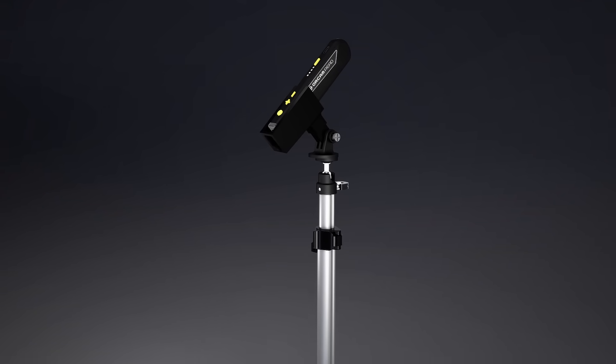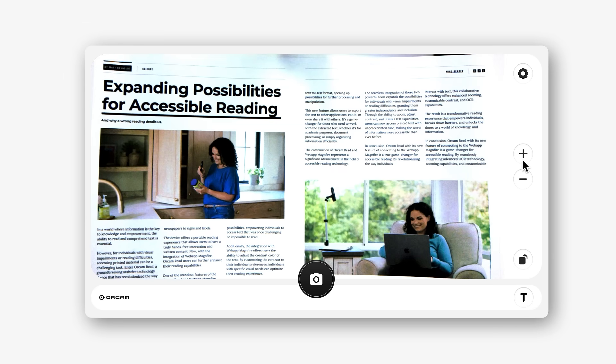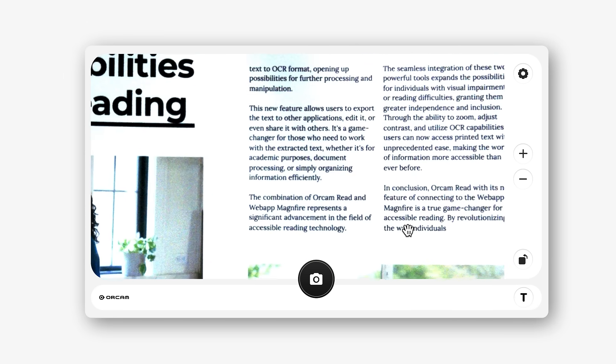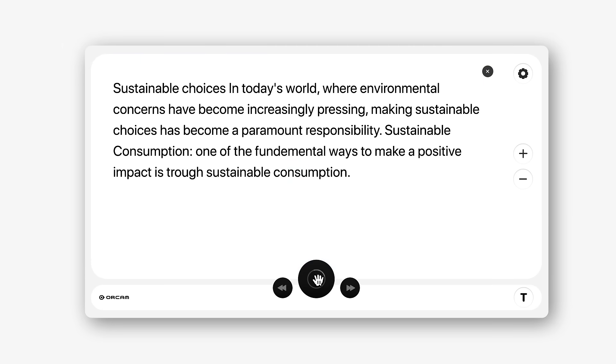Welcome to the new OrCam Read 3, your all-in-one solution, equipped with the next-generation online magnifier. A comprehensive solution for viewing everything from important documents to family photos and even handwritten letters.